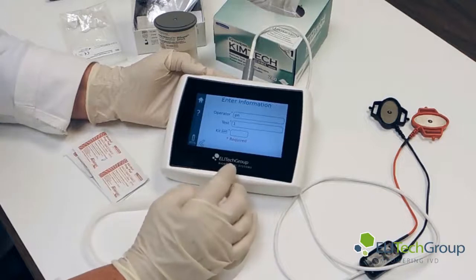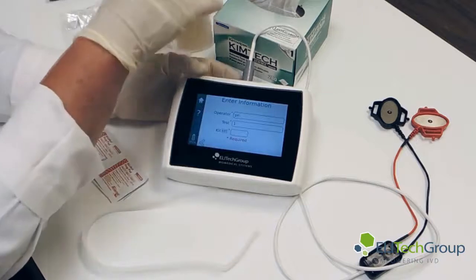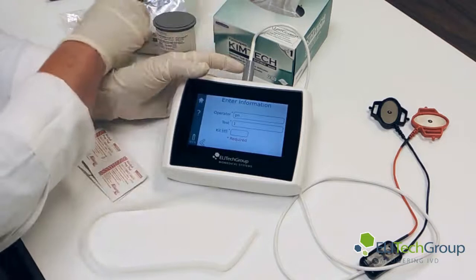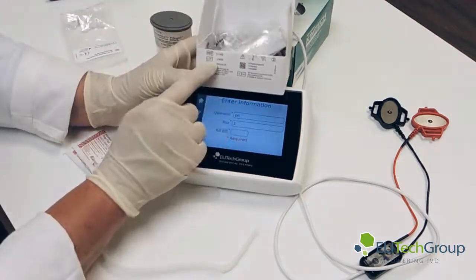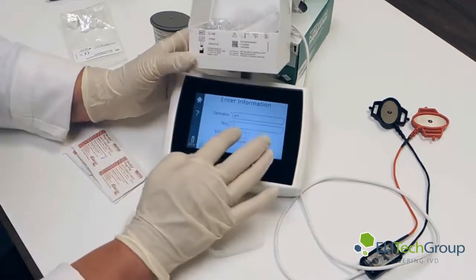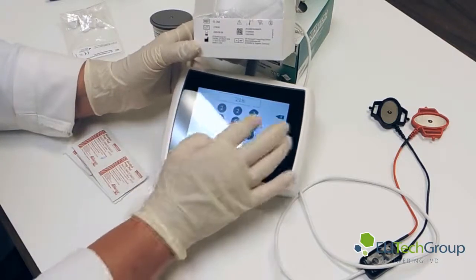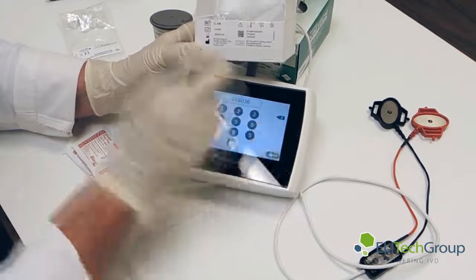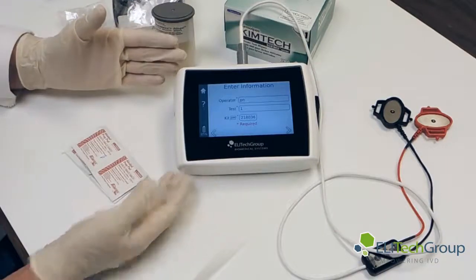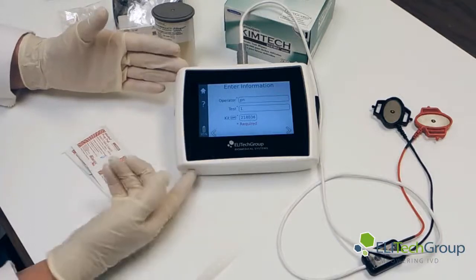We advance on to the kit number. What we're looking at is either you can use the kit number here or the lot number of the PilotGel disks — I prefer to use the kit number. The lot number is located here: 218036. It is required, so we enter 218036. As you can see, all information has been entered — the operator, the test number, and the kit number.